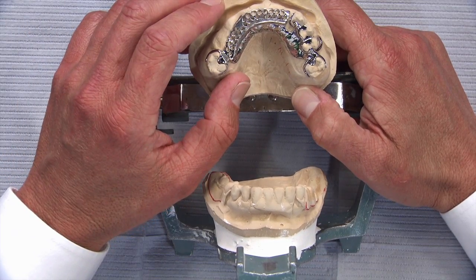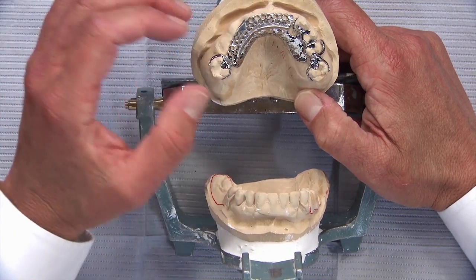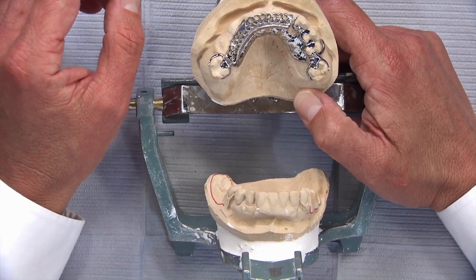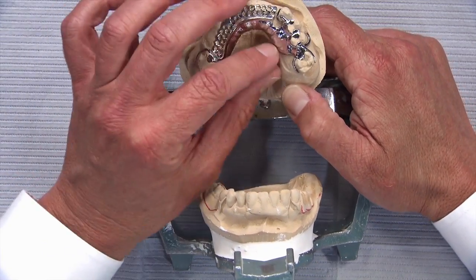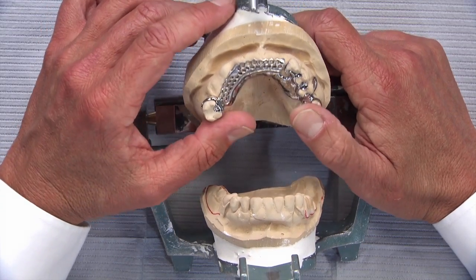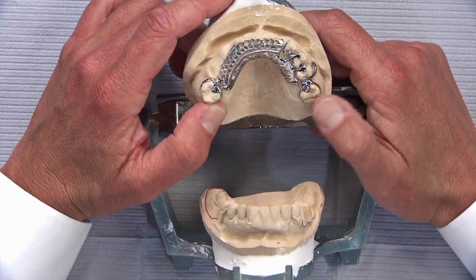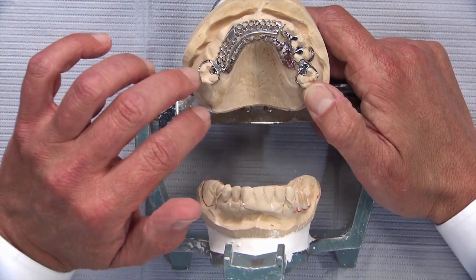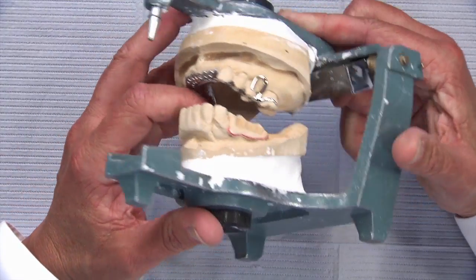We try to design the major connector as similar as possible to what the patient has already accommodated to in the past, to their tongue. So even if we see something that might be a more clever design or might be a smaller palatal strap, if the patient is used to something and hasn't complained about it, it's often the best idea to go ahead and replicate that and make sure that they don't have to learn something all over again. So if we can see the indentation on their palate where that was, that's even more helpful.